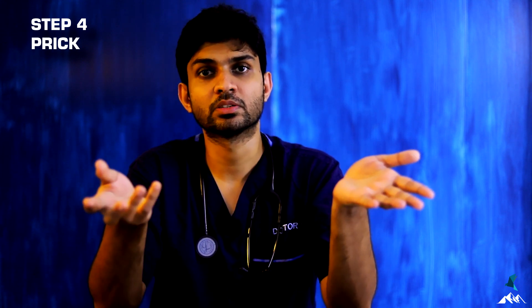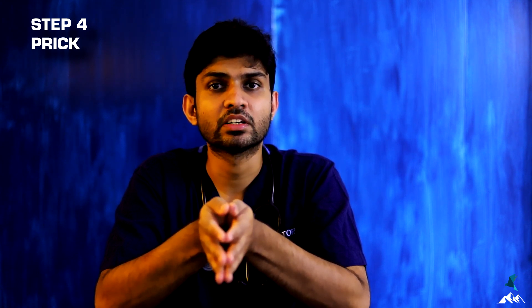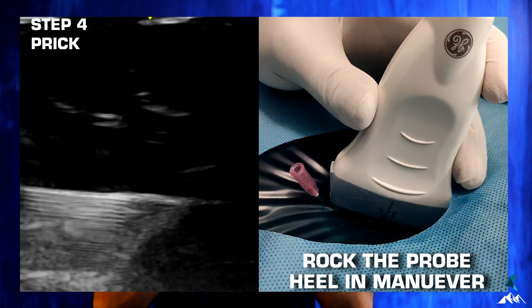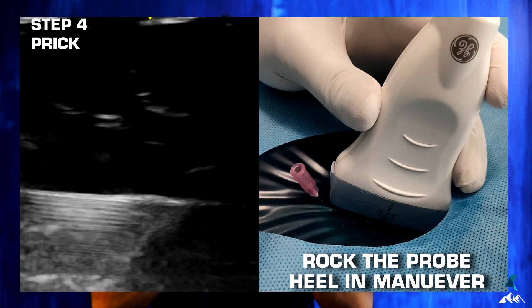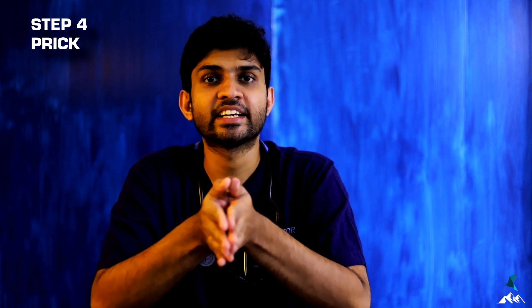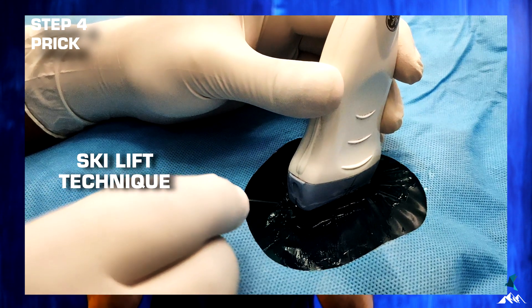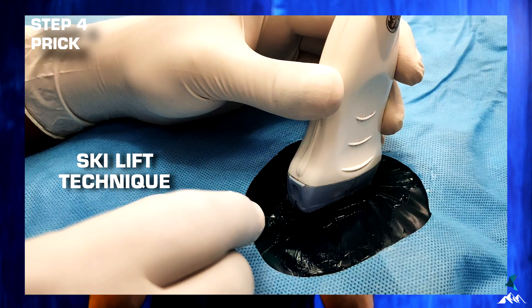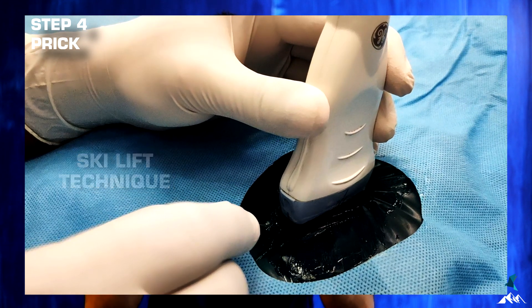For deeper structures in the in-plane technique, you can do the heel maneuver — rock the probe by putting pressure on the distal part to reduce the angle of insonation, getting a more perpendicular beam, which improves needle visualization. Another option is the sky-lift technique: lift the proximal part of the probe, insert the needle just under the probe, then put the probe back in position. This helps insert the needle in the exact narrow path where the ultrasound beam travels.